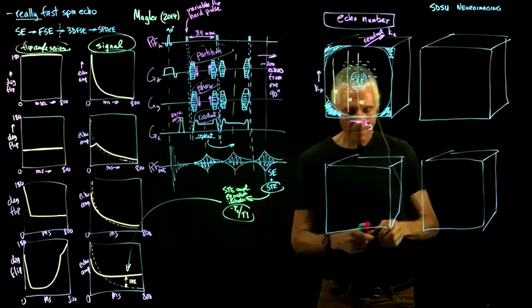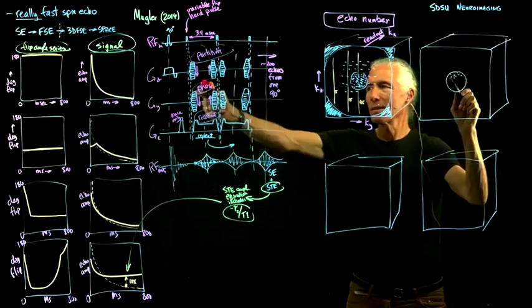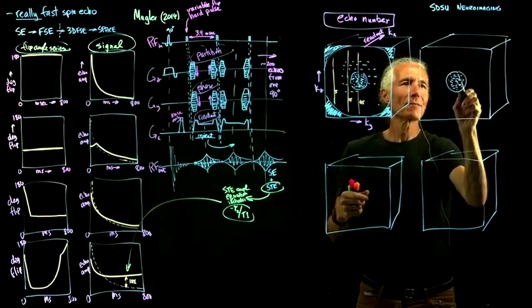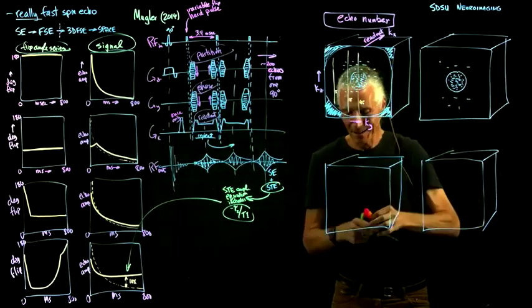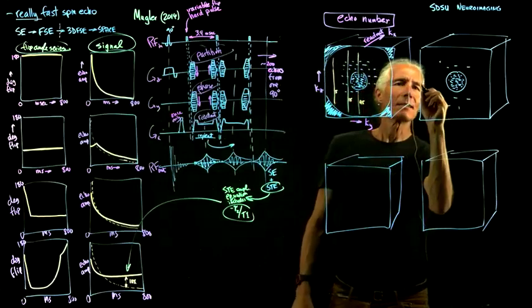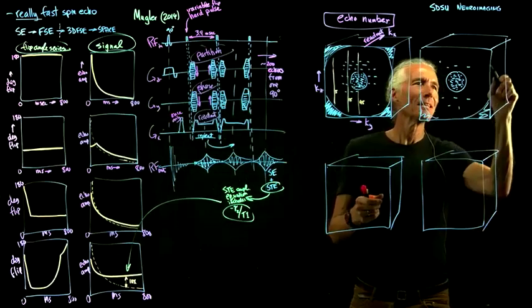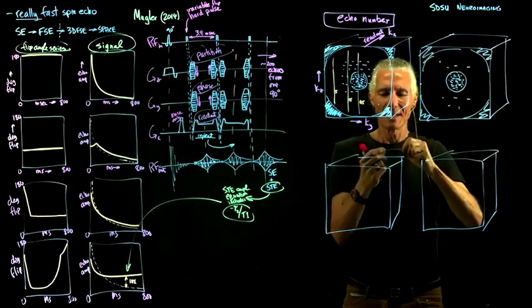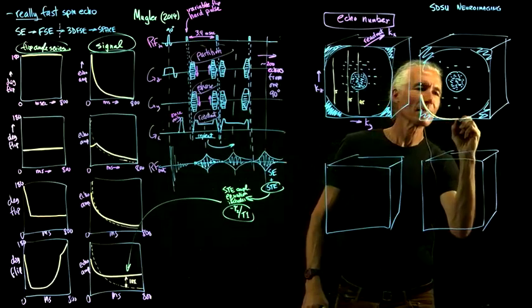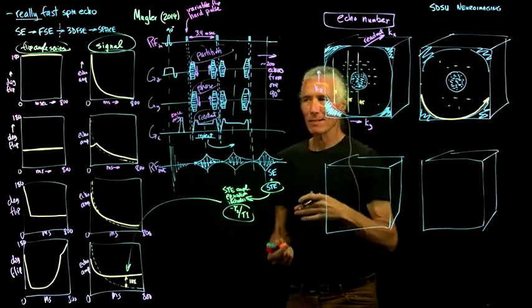So what are the actual individual echo trains, like one time through for 190, look like? So here's that. They're denser in the middle, so we've got to somehow accommodate that. And so what happens is, don't forget to throw away the edges, don't bother with that. So here's our first echo train, it goes like this. And so why do we do that? Because we don't want to record the center of k-space right at the beginning, because we want something that's T2 weighted.